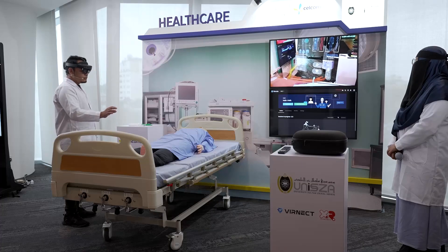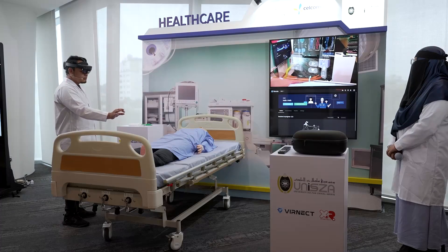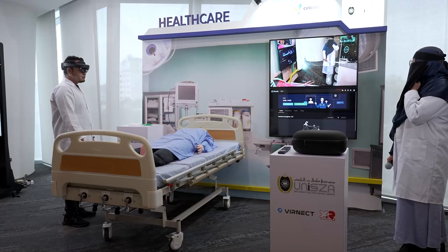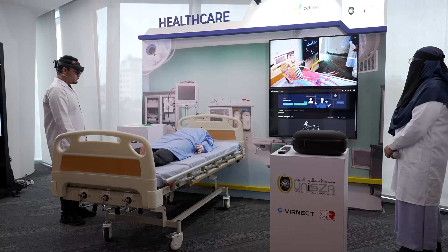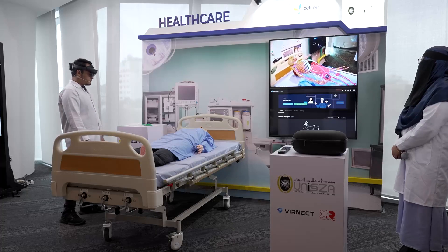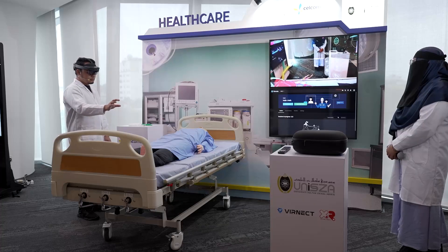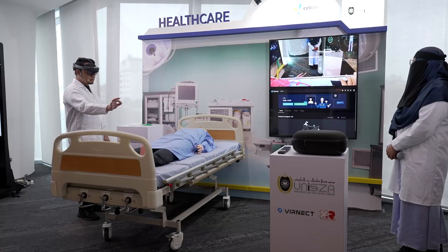Now we need to go to anatomy for an in-depth examination. I see the anatomy button and navigate to it. For the skeletal view, I click the right-hand skeletal button to diagnose.